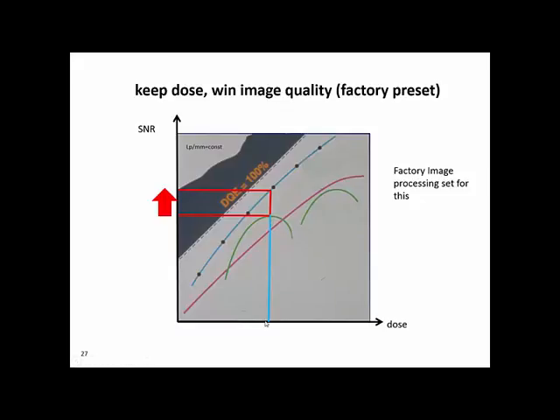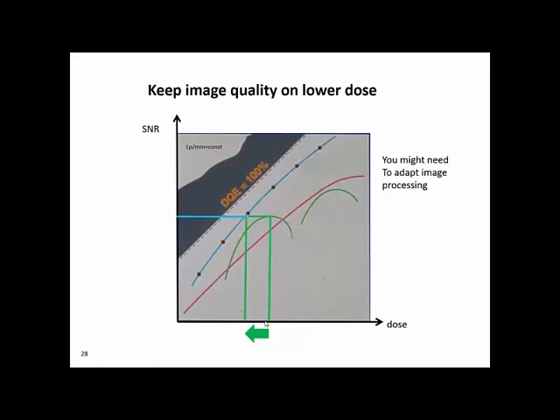The customer can use this and will have success with image quality, and maybe there is no need for changing that. But of course some hospitals would like to save dose. We have pediatric hospitals, we have special questions on follow-up studies where people would really like to save dose, in which case the customer could tell us to do that.